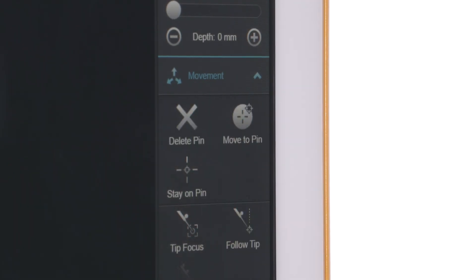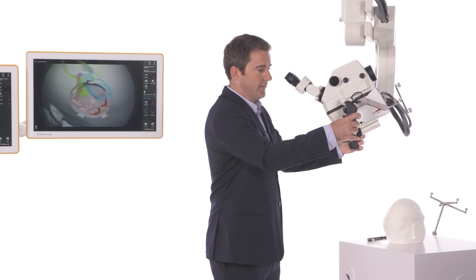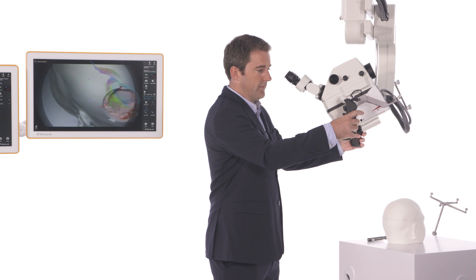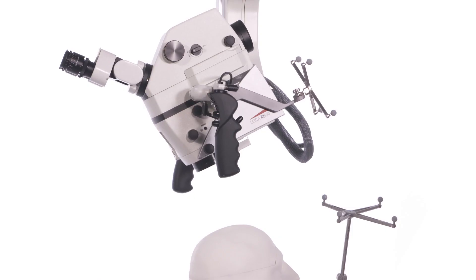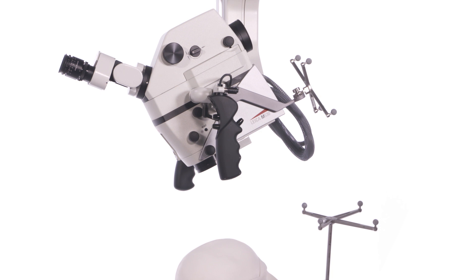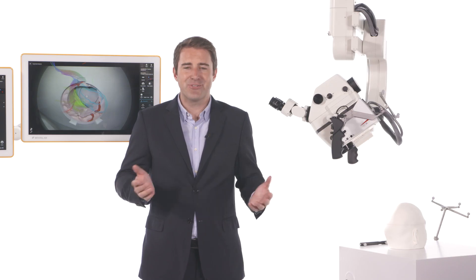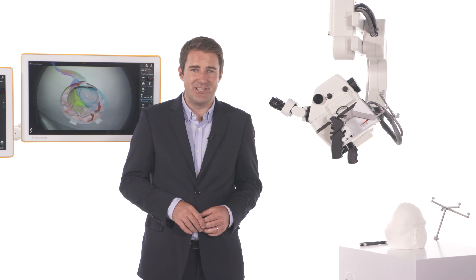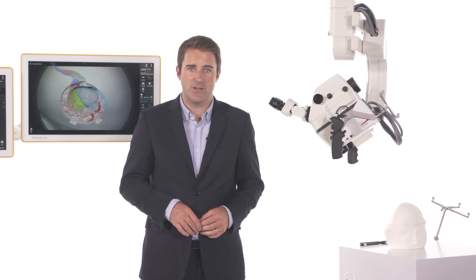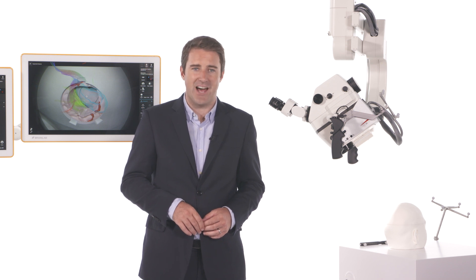Setting a pin defines a landmark to return to for observation of the target from different angles. Stay-on pin automatically compensates for small movements of the OR table. Microscope navigation delivers augmented visualizations and improved ergonomics, allowing surgeons to stay focused on the surgical task.